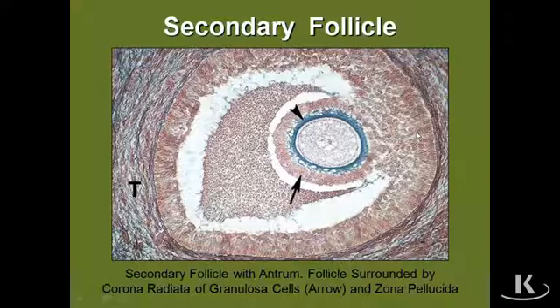Perimeter of the secondary follicle. And then indicated by letter T are the theca interna cells that lie outside the granulosa cells.